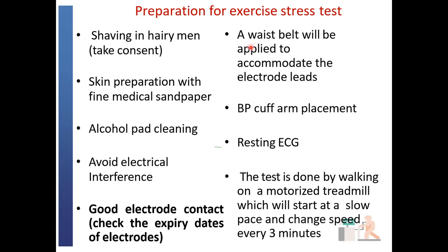Patients who are hairy on their chest should be shaved, because that will affect the placement of your electrodes. Ideally, skin prep should be conducted with fine medical sandpaper. Usually here we don't have that, so I usually use methylated spirit with cotton wool to clean properly. You should avoid electrical interference. This will ensure good electrode contact. Always endeavor to check the expiry date of these electrodes.